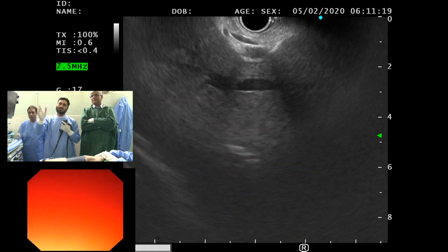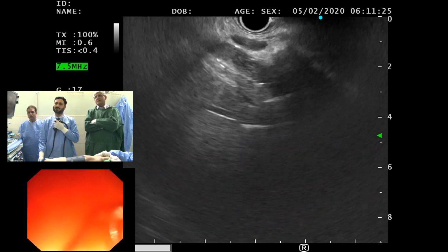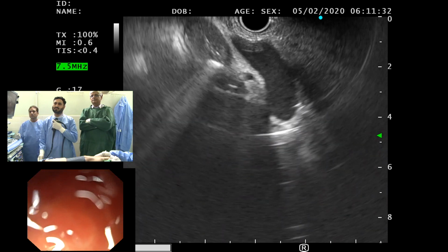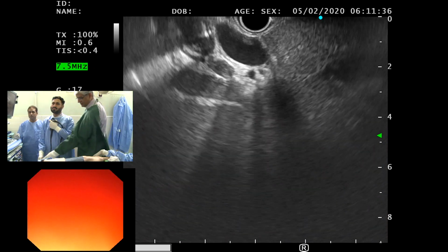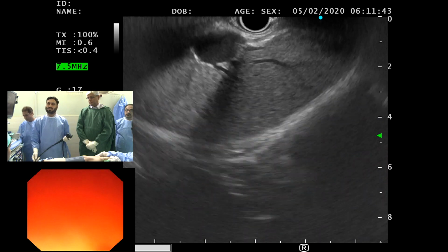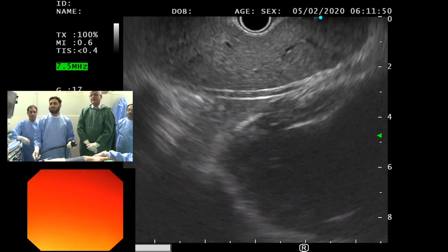Now you've got liver, so you want to rotate. Yeah, keep rotating. You need to pull back a little bit. You are rotating, but that's not rotating fully. So keep going. So we've seen the liver in that process as well.